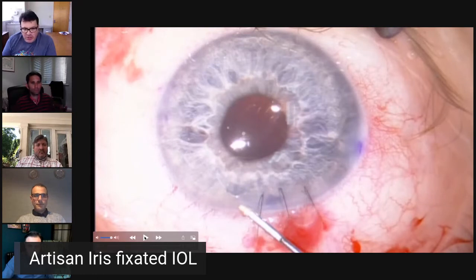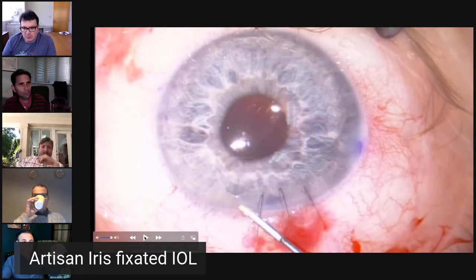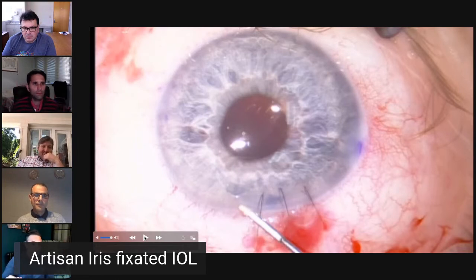So a quick question here for Felipe. Do you think dilating the pupil later on for retina examination is safe with an Artisan IOL? It's usually a question that people tend to ask. Well, I think it's perfectly feasible. Remember that the lens is anchored in the mid-periphery of the iris, and it shouldn't interfere with the action of the sphincter pupillae or the dilator. So I've never encountered any problems from that point of view.